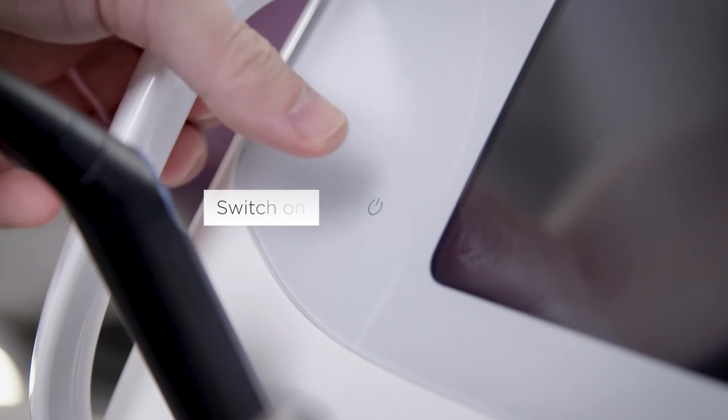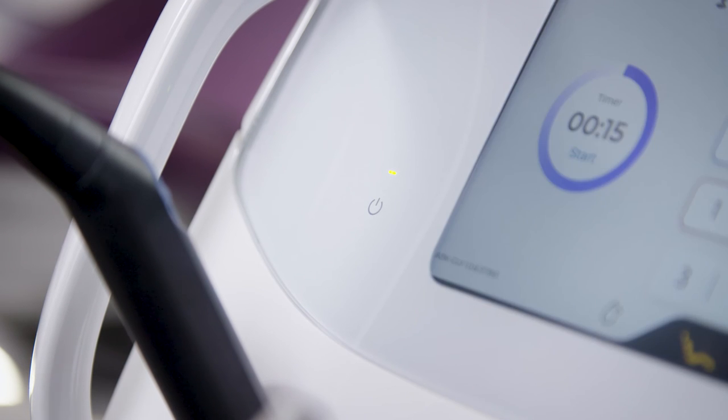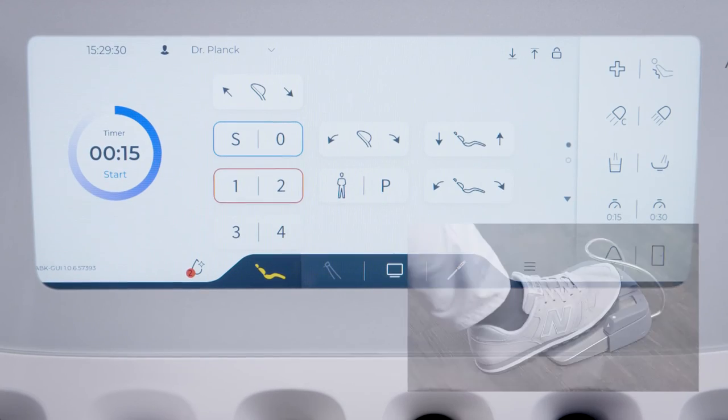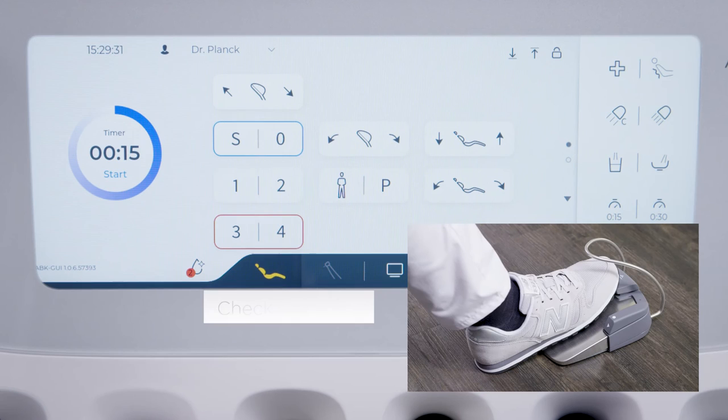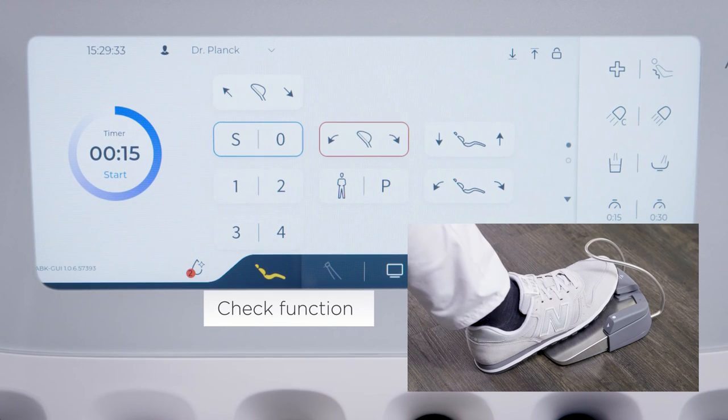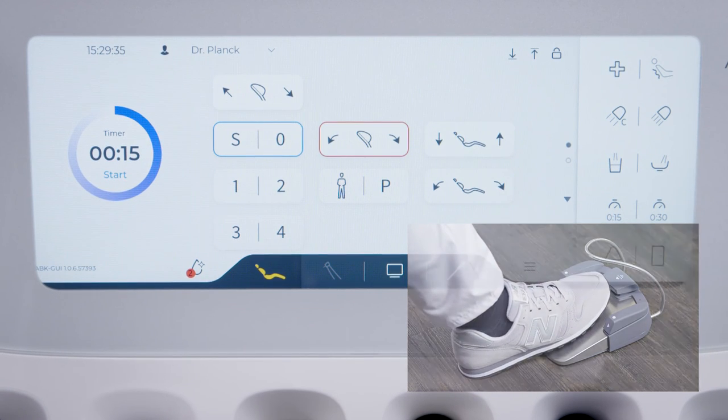Switch Axano on again after replacing the battery and check its function. You do not need to log in to smart control again after battery replacement. You can continue working immediately.